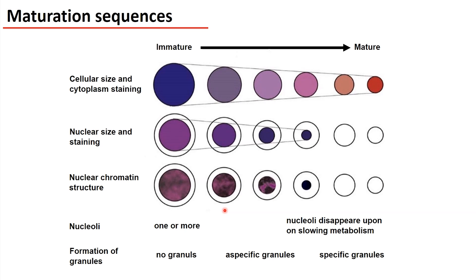Granules. Certain cells, especially the granulocytes, contain granulation. At the beginning, in the blast phase, there are no granules. However, during the maturation, first the azurophilic granulation comes. Later on, the specific granules will dominate the granules in the cytoplasm.